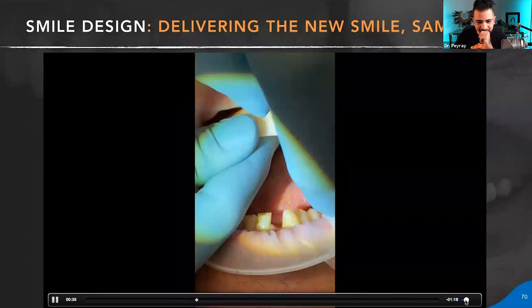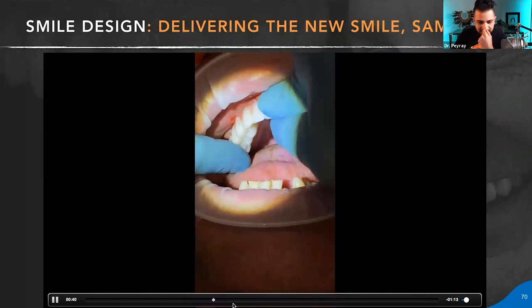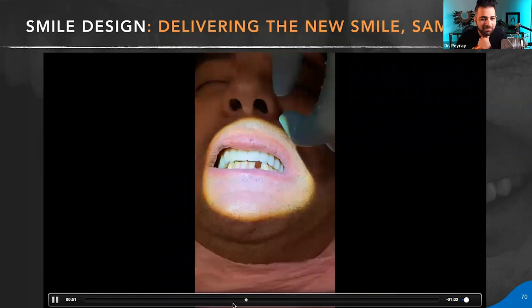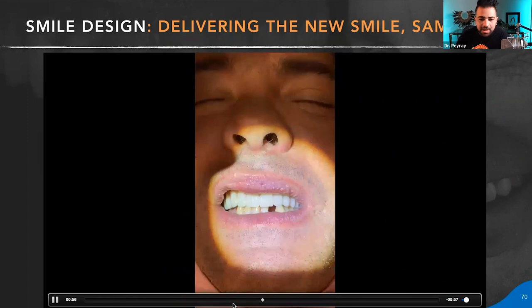Now you're going to feel a little pressure, okay? Teeth are going in. Perfect. Just try to hang in there, honey. Perfect. Big. Show me them. So once you screw them in, I'll show you before and after of how this smile design we predicted is so close to what we ended up with.